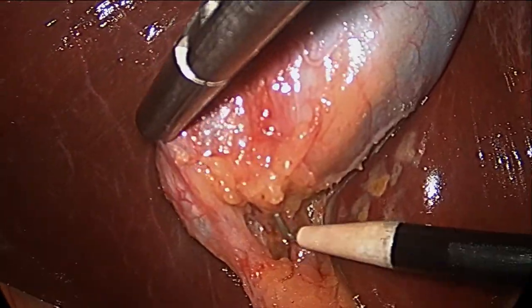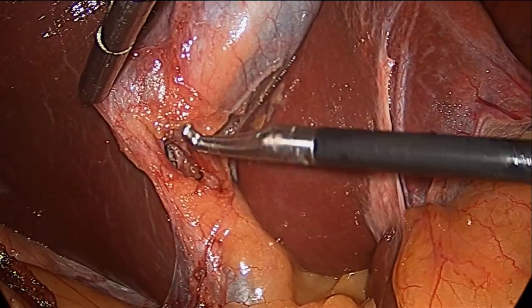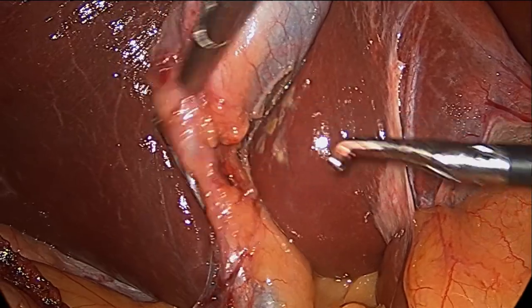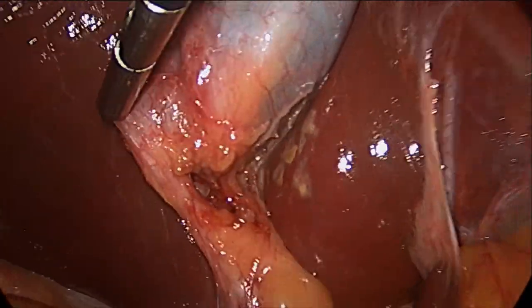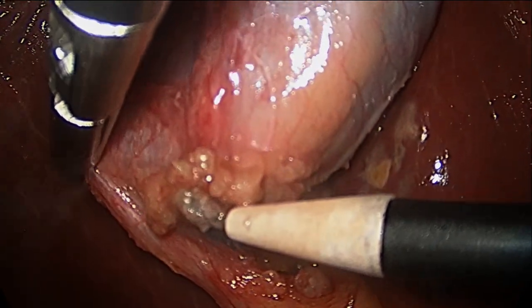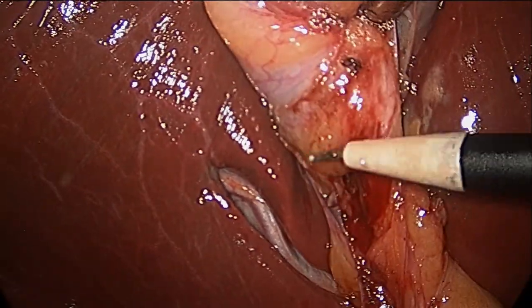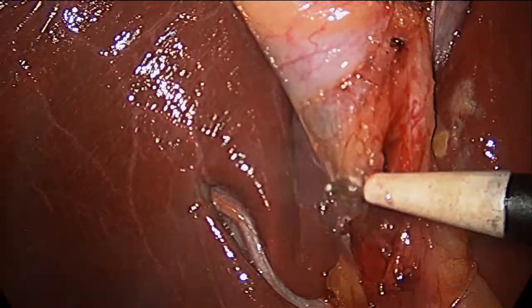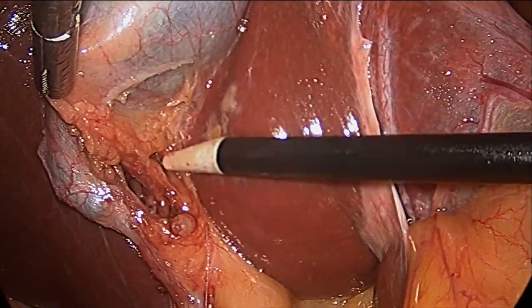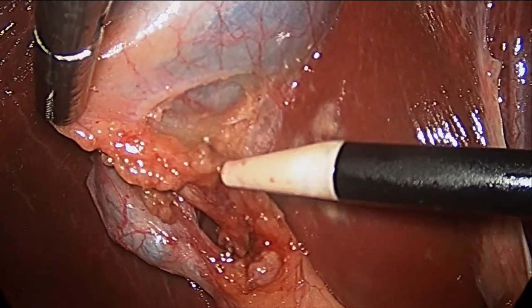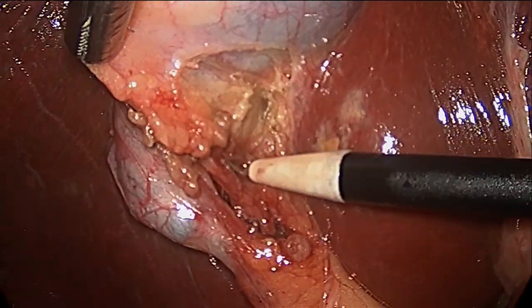It looks like we've isolated the gallbladder duct. In this situation I use fine dissection to create an even larger window. We also see another structure, most likely the artery of the gallbladder. I always, whenever possible, remove all fibrous tissue and expose these structures. As a result of dissection we see two structures that go into the gallbladder — the duct and the artery.